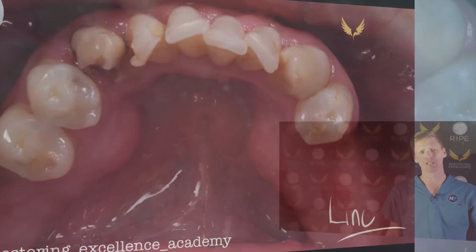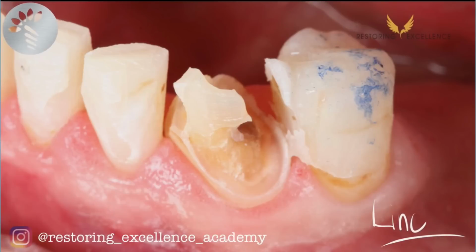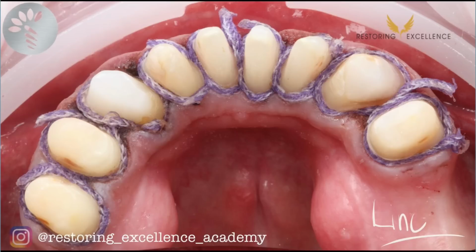So once again, same thing. We've got to have cores, big blob of composite, we build it up, we have to get tissue control on the deeper margins, then thin cord in place, and then thick cord in place, and it's very important to wait with a full arch prep. Because you definitely don't want any bleeding, you don't want tissue collapse, you don't want anything happening. It's super important to wait so that you know the tissue is not going to collapse on you, okay?